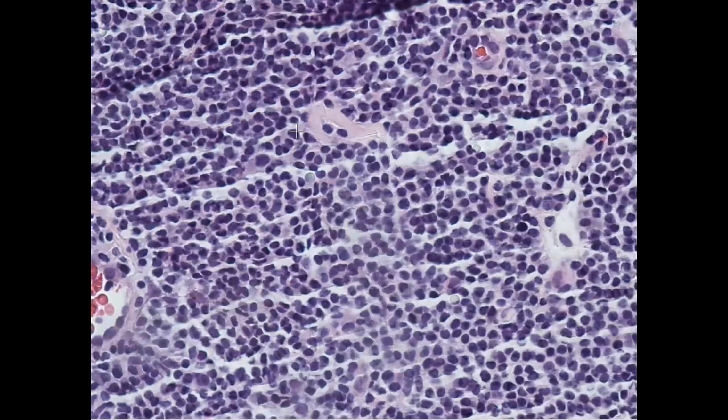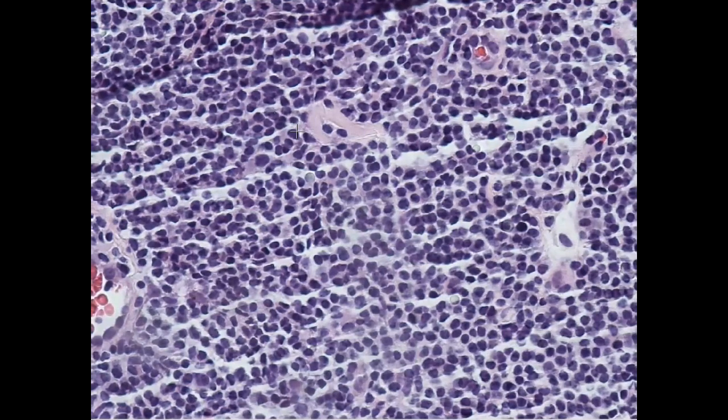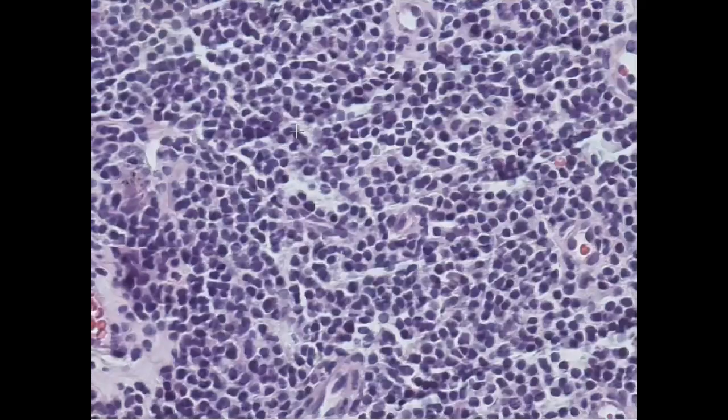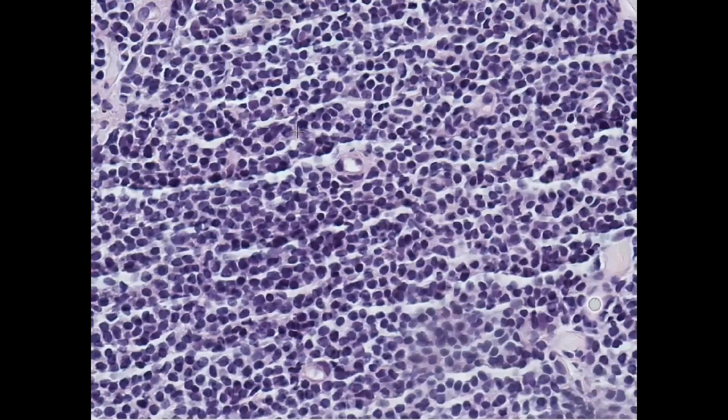In the background, I can't see any inflammatory cells, just the same lymphocytes that are infiltrating all through. And here is the same. So I will take it step by step, and I will go with the immune stains.